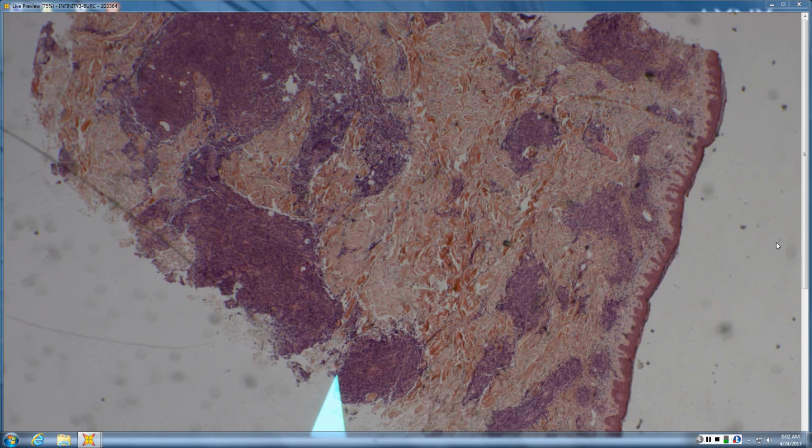In lymphoma, you get what's called the piranha sign, where those BCL6 cells jump out of the fishbowl and they're out where they don't belong. In benign reactive, the BCL6 stay where they're supposed to stay. The BCL2s stay where they're supposed to stay.